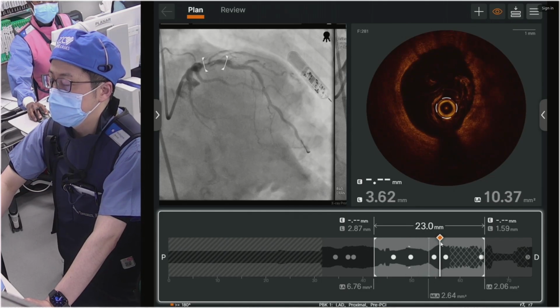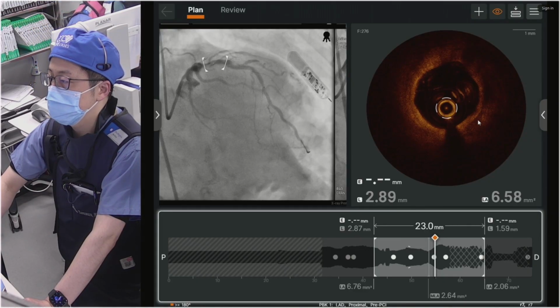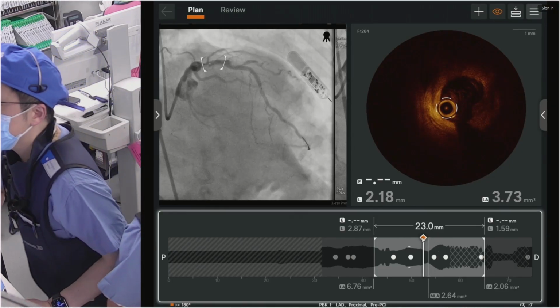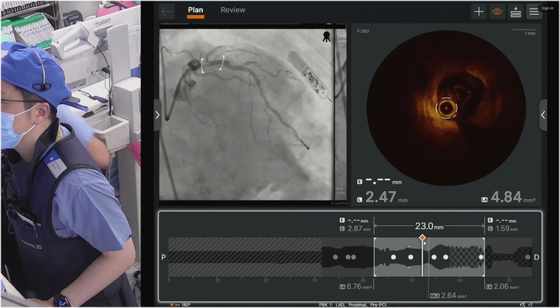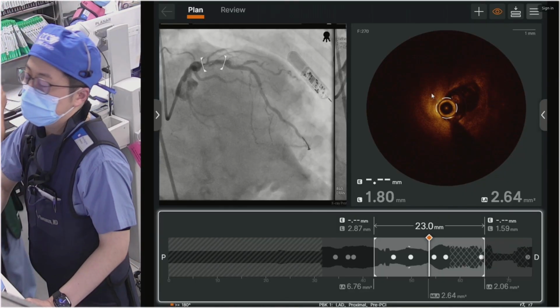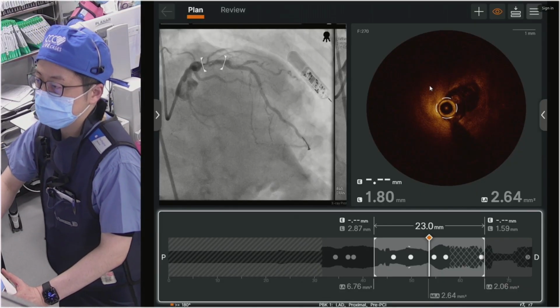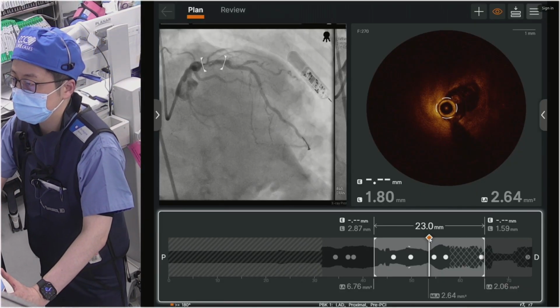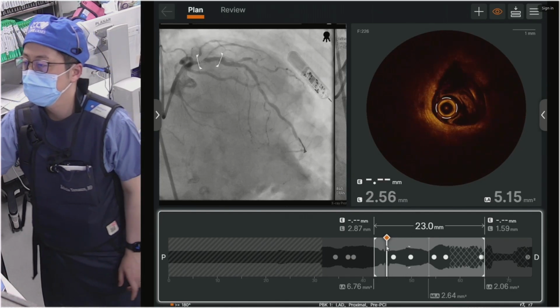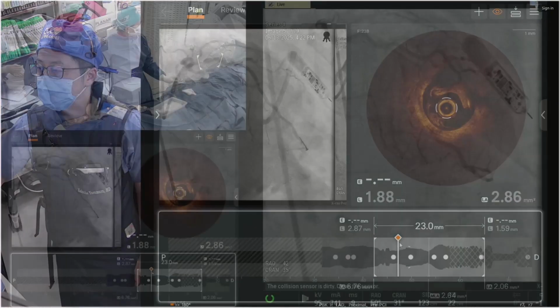If you look at it, it has a glow like it's soft tissue. Distally you see that, but proximally it looks all like lipid-rich plaque. It does have that kind of glow, totally diffused, with no well-delineated border, like attenuated plaque. Yeah, looks like possibly lipid plaque. Maybe we just cut it then. Let's see the fluoroscopy. It does, though, on angiography, have a soft tissue glow to it.